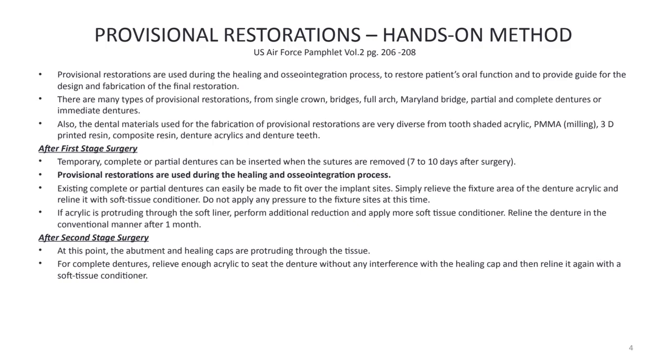In this presentation, we're going to talk about provisional restorations for dental implant cases. Provisional restorations are used during the healing and osseointegration process to restore patients' oral function and to provide a guide for the design and fabrication of the final restoration.